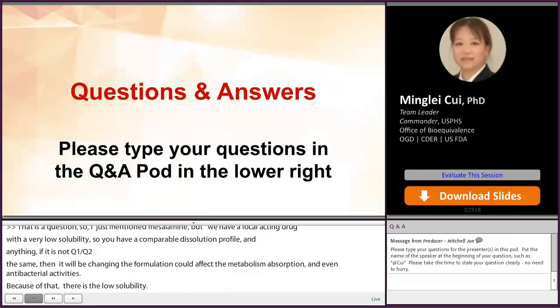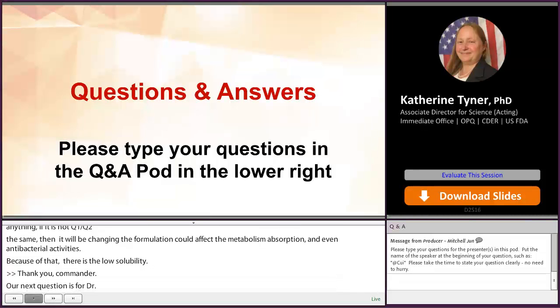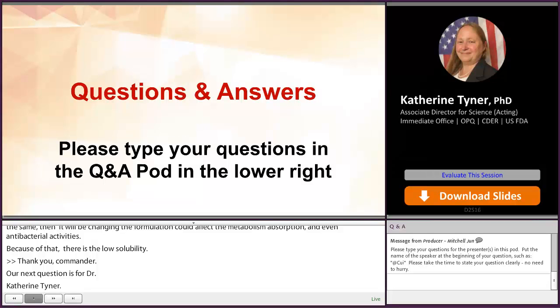Thank you, Commander. And our next question is for Dr. Tyner. When performing an NG tube study, it is assumed that the delivery of the dose is performed by injecting with the syringe by the use of a plunger and not by gravity.